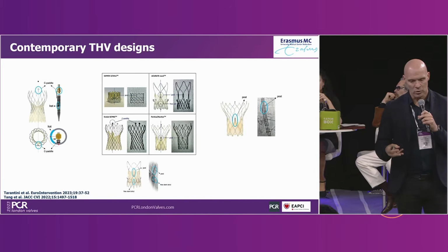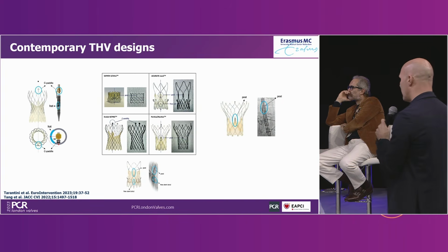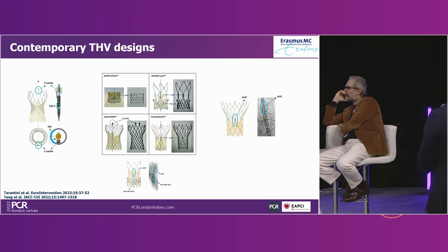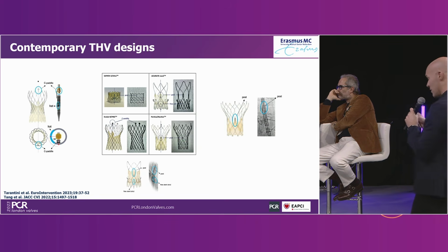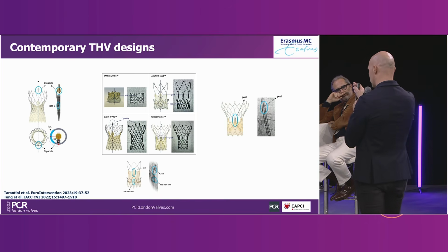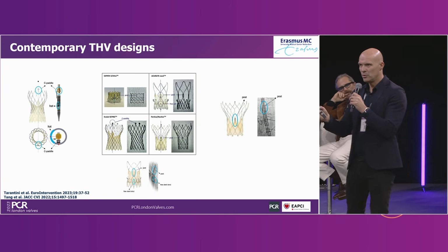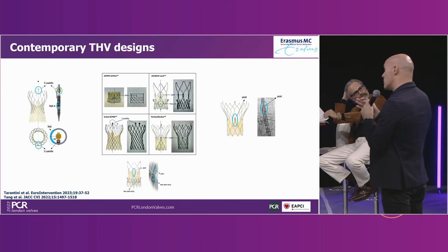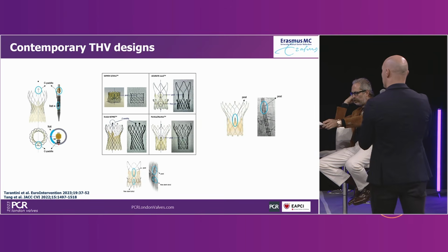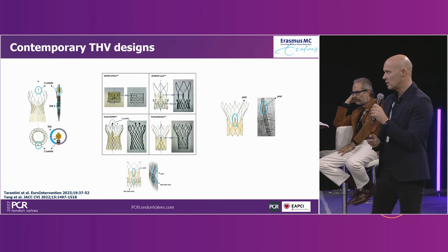When you use these devices, you really have to understand how you commissurally align these platforms, because it's very clear that if the commissure post is right in front of the coronary, whatever you do, it's going to be very difficult to re-access the coronary, and you will end up with suboptimal engagement. It becomes very difficult to align your guiding systems with the coronary ostia.